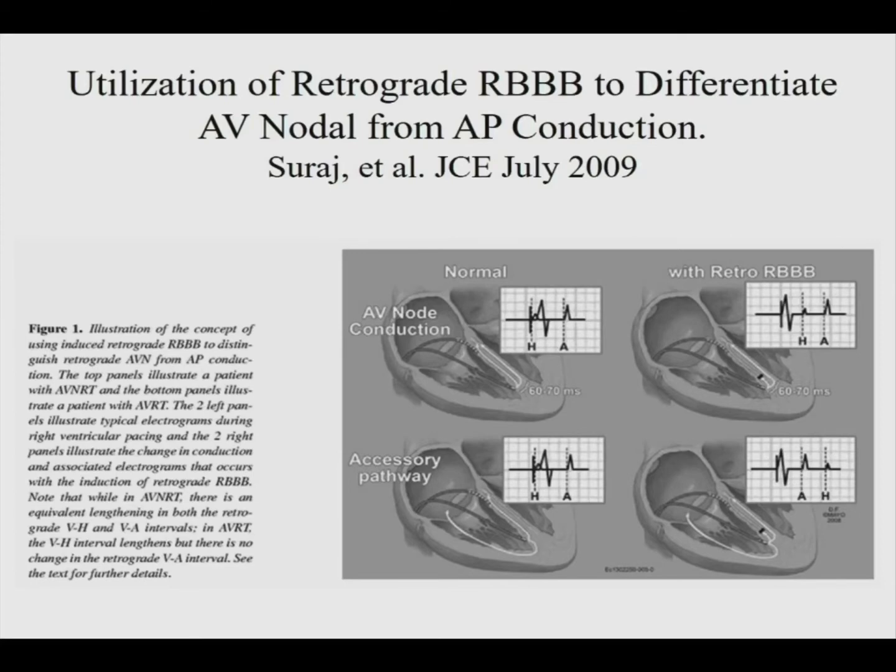One is how fast it is, right? What's the tachycardia cycle length? We talk about the RP interval with catheters up. It's the VA interval, particularly the septal VA interval. And if you can't see it, you can look at other VA intervals. What other things happen during tachycardia that are useful diagnostically?